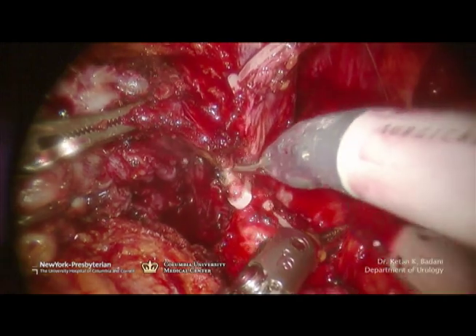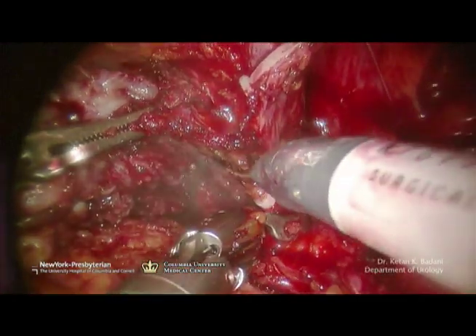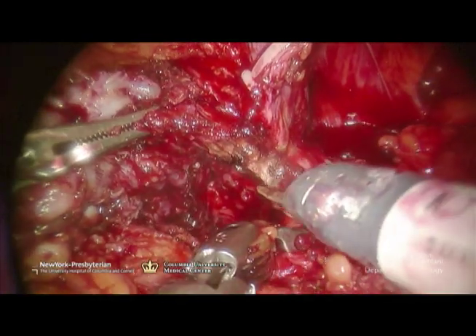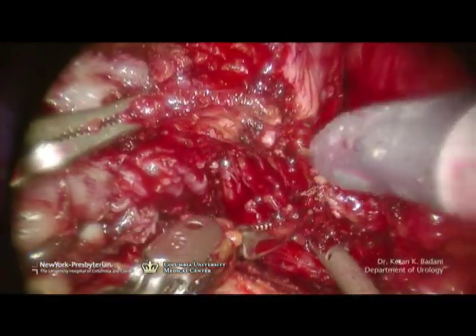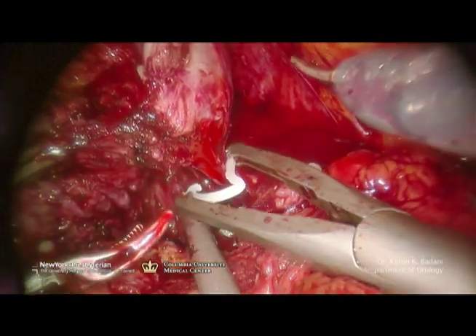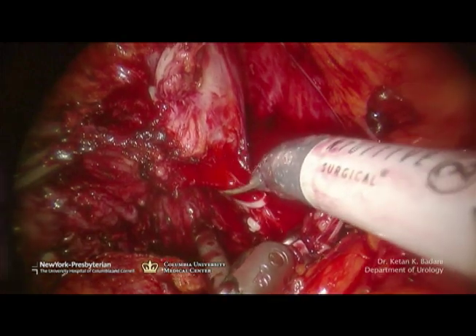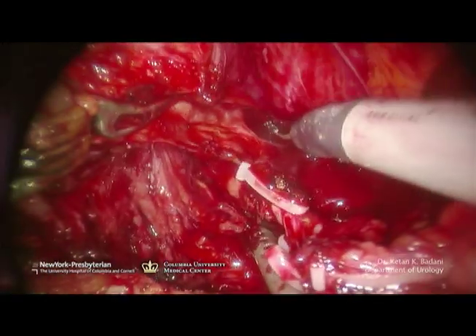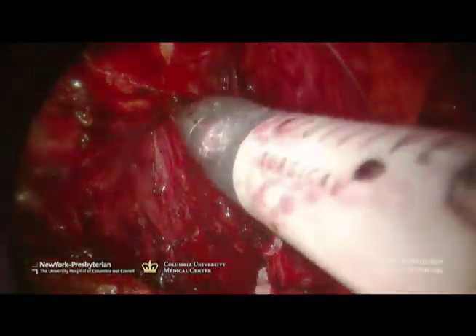Right-sided standard or traditional nerve sparing. This is the traditional posterolateral nerve sparing, as opposed to the lateral prostatic fascia nerve sparing, which will be shown in a separate video segment. Here the pedicle of the prostate was clipped using hemo-lock clips and divided. We're doing a minimal nerve sparing operation on this gentleman given his poor erectile function preoperatively. However, the clips not only provide an athermal means, but they are also better hemostatic maneuvers for any large venous sinuses that may exist in this area. Once the pedicle is divided, the plane is found between the capsule of the prostate and the nerve bundle. You can see the shiny white capsule of the prostate, making sure I leave a small rim of tissue on the prostate itself.